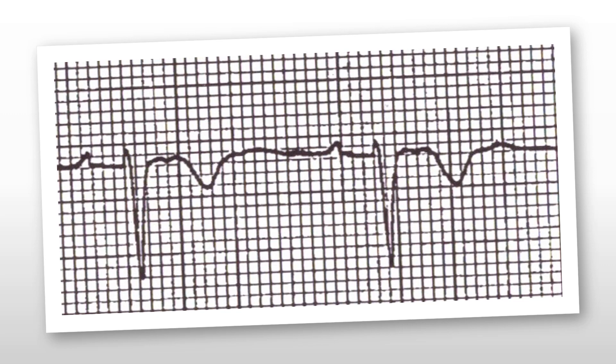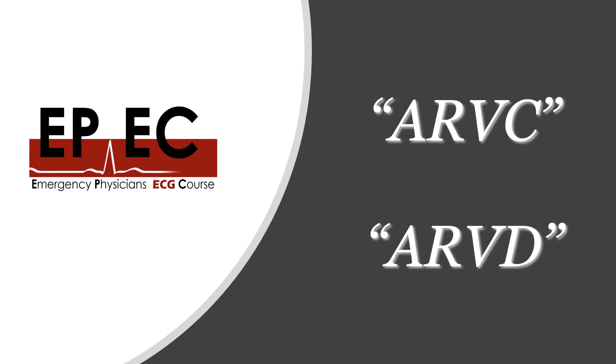Moving on, in V1 to V3 — especially V2 — there is a weird-looking notch at the end of the QRS complex and the beginning of the ST segment. This is the second abnormality. Combining both abnormalities together leaves us with only one diagnosis: ARVC or ARVD — arrhythmogenic right ventricular cardiomyopathy, also known as arrhythmogenic right ventricular dysplasia.